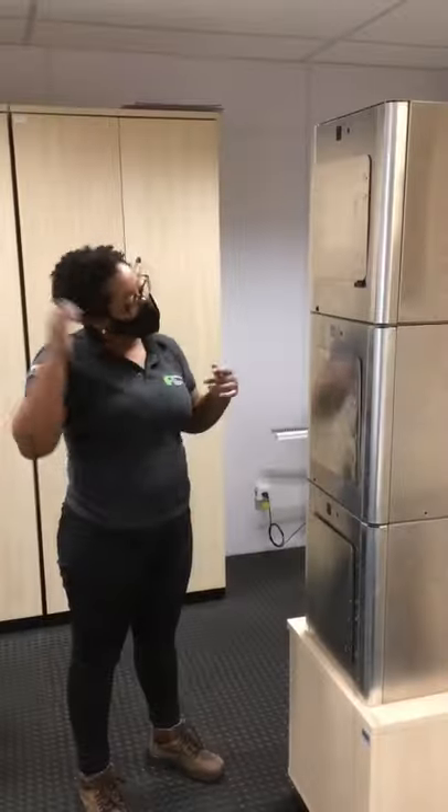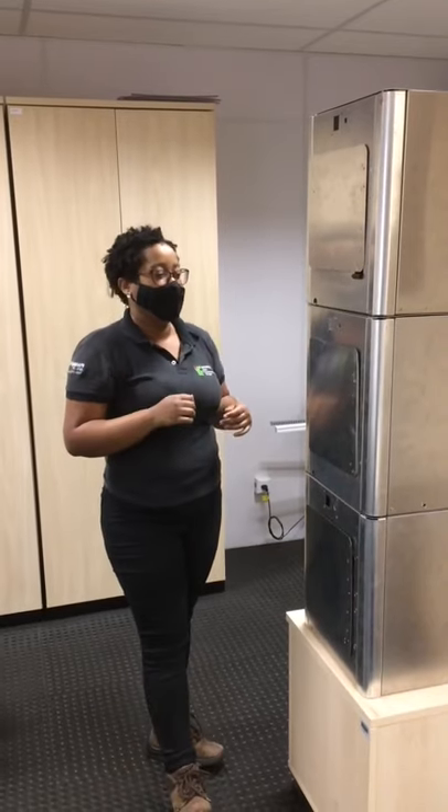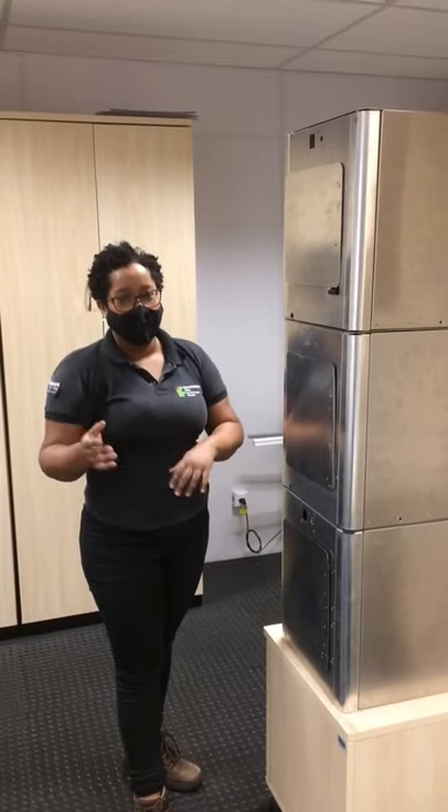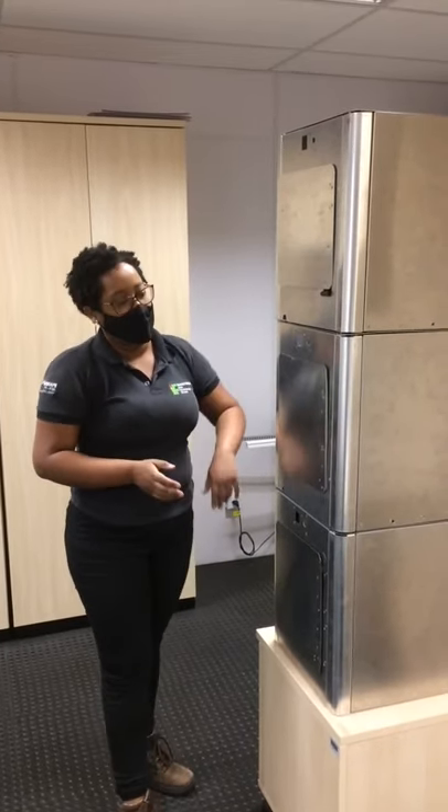Bom pessoal, aqui está a nossa torre de esterilização semifinalizada, já com alguns ajustes implementados. Então, vou estar mostrando ela antes de ligar na tomada.